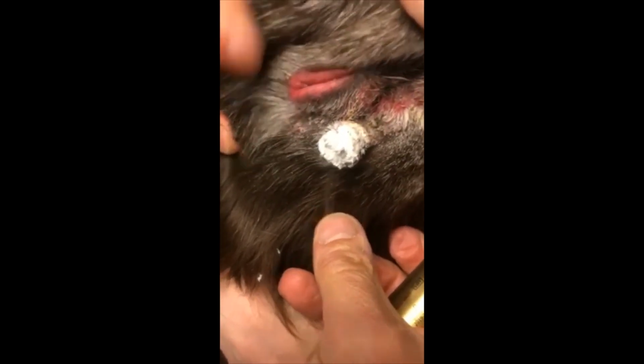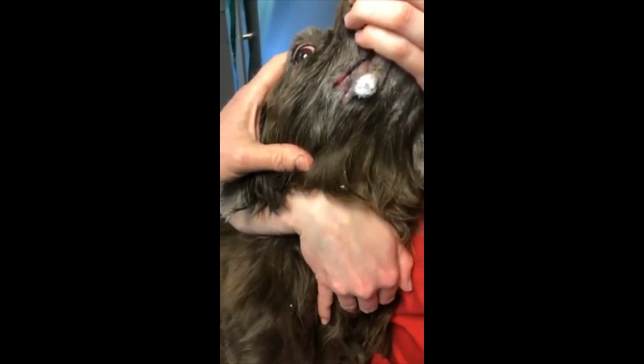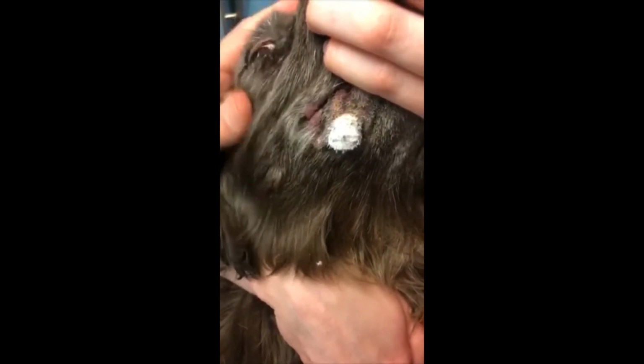It'll probably take in a mass this size approximately 3 weeks for this tissue to completely necrose and scab over, at which point we typically recheck them. In some cases, in a large mass as this one, we'll need to do a repeat treatment.